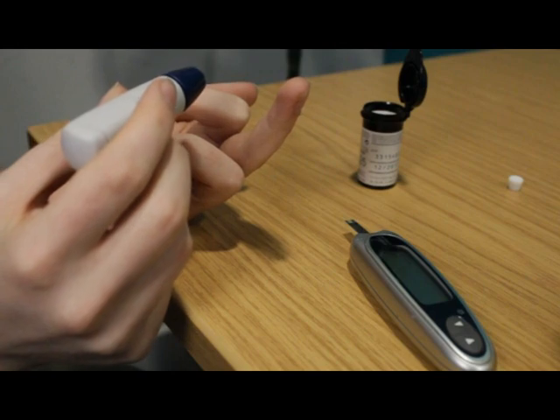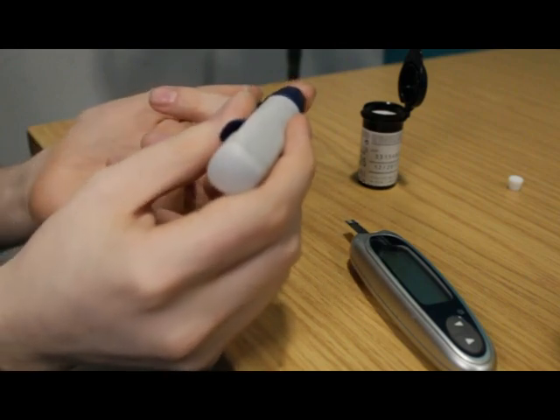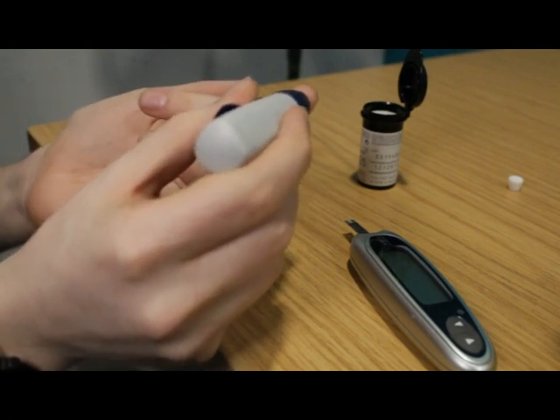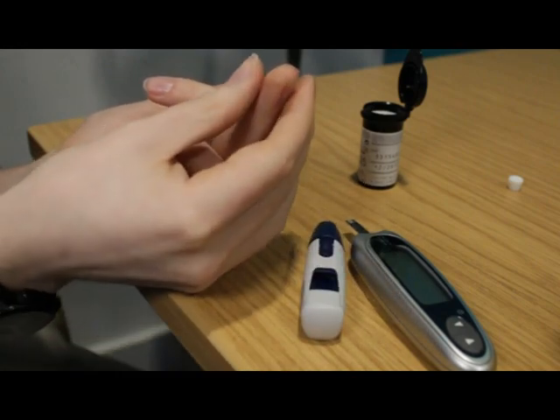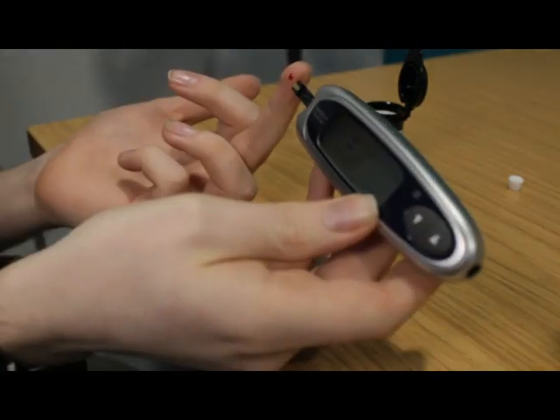Rotate your fingers — don't always use the same one. Avoid the thumb and forefinger. Place the finger pricker against your finger. You can also use alternative sites; your healthcare team can advise whether this is appropriate for you.